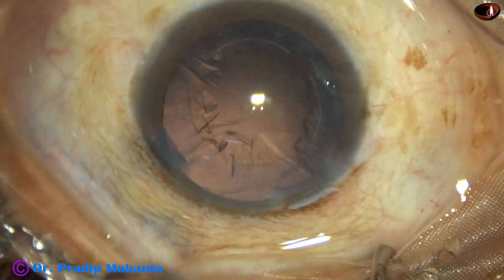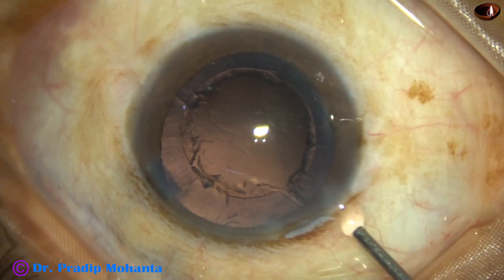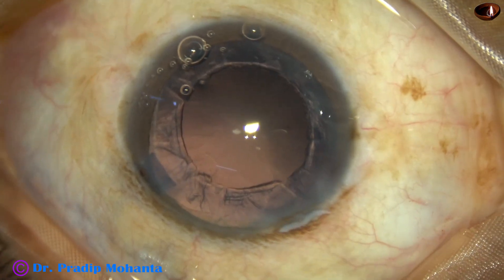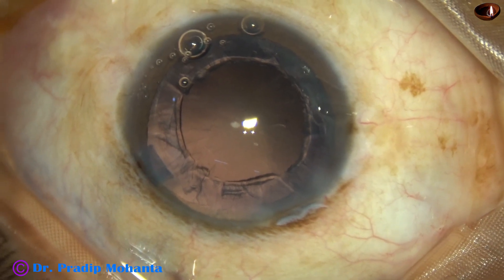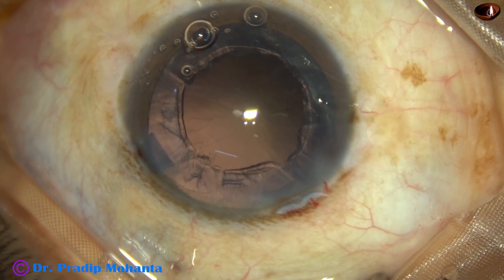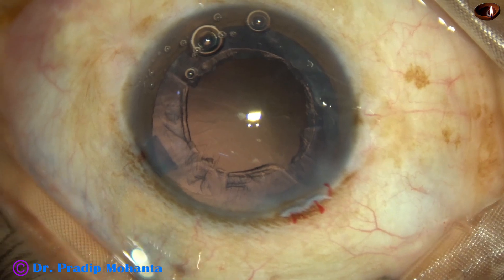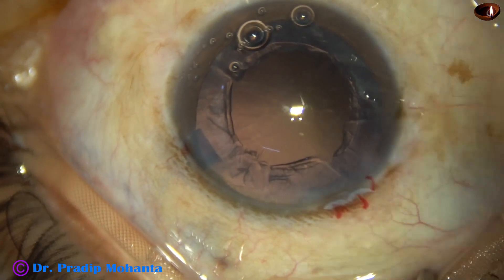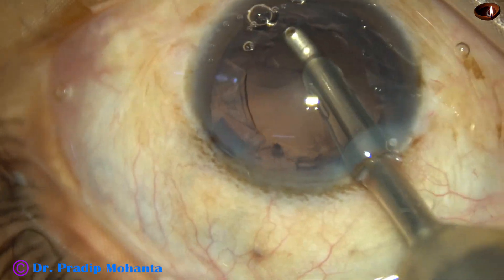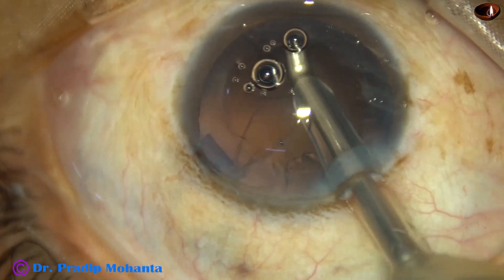So, the nucleus and epinucleus is managed. Now, there is a lot of cortex all around. I am going to use a coaxial irrigation aspiration device to remove most of the cortex. The coaxial IA goes in and I start aspirating the cortex, starting from 5 o'clock.